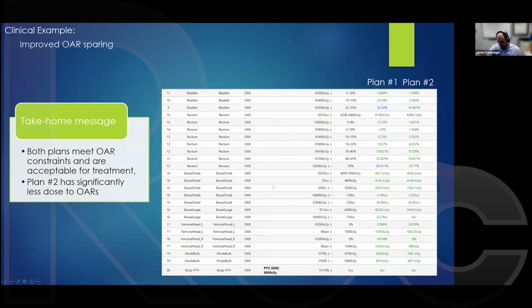And so here's an example where we have bladder, rectum, small bowel, femoral heads, penile bulb, and there's two different plans here, but you can see here's the metric for dose, so V58 gray or 5800 centigray, the range of volume that's acceptable, and then you can also compare a couple of plans if this is set up with the software that allows for it, and get the sense of, oh, do both of these plans meet those metrics? Great. Maybe you move on to the next metric.